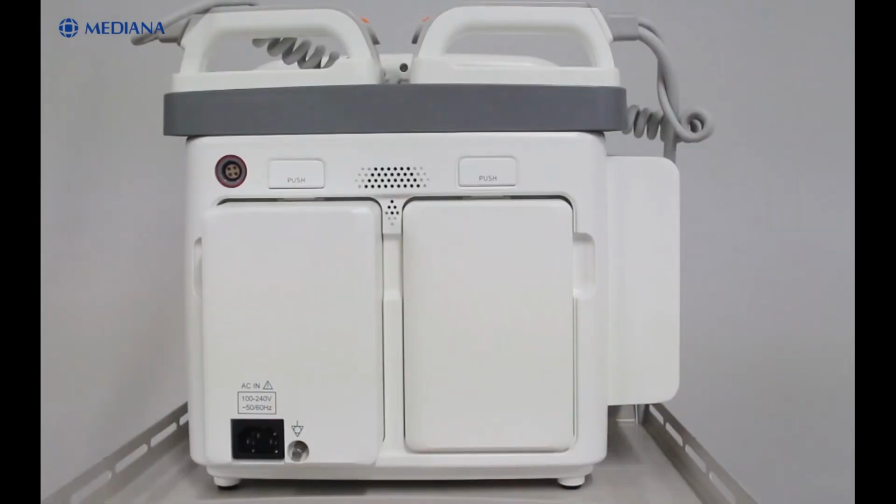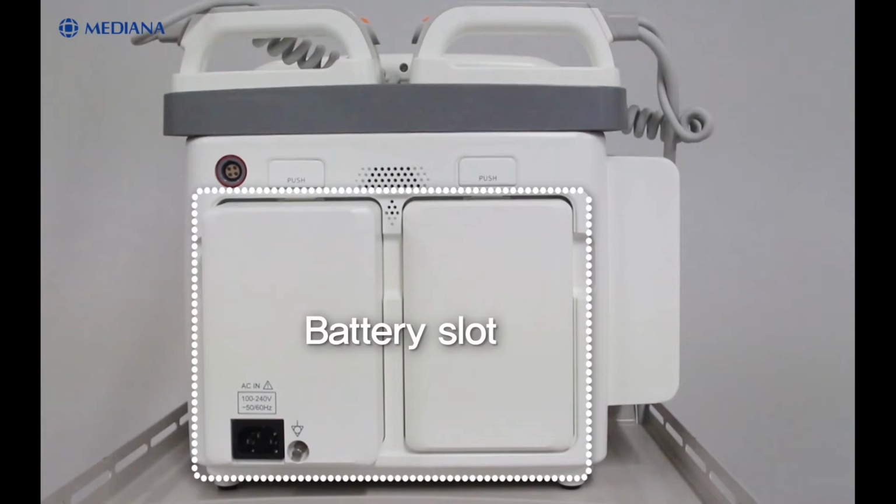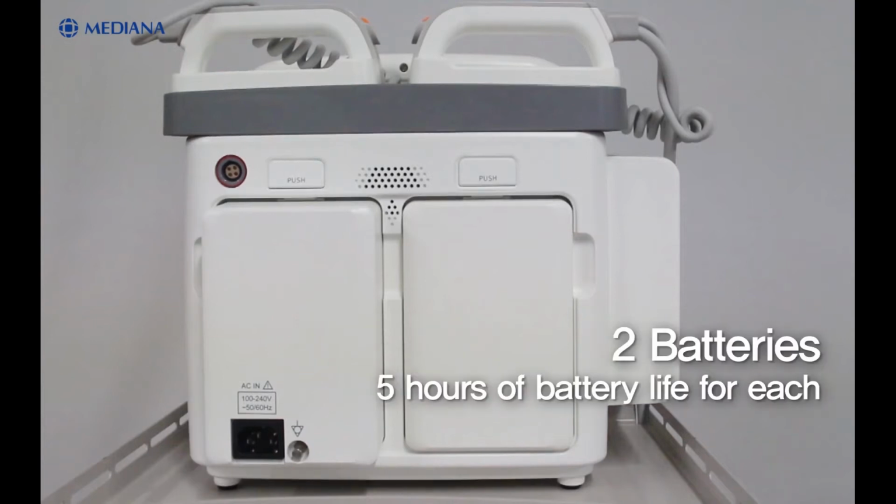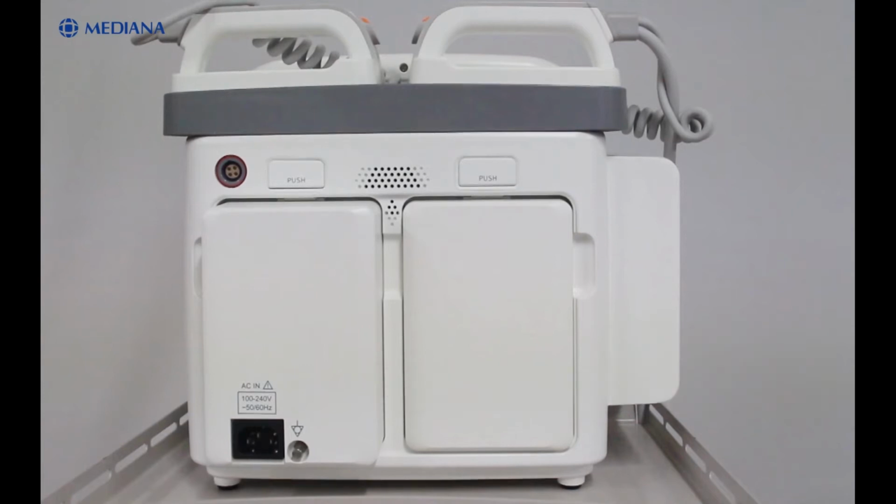To see the components across the rear panel, you can see 2 battery slots and the push buttons. You can operate D500 with 2 batteries, 5 hours of battery life for each, so you have 10 hours of operating time with 2 batteries. And also, you can use this power supply in the left slot.